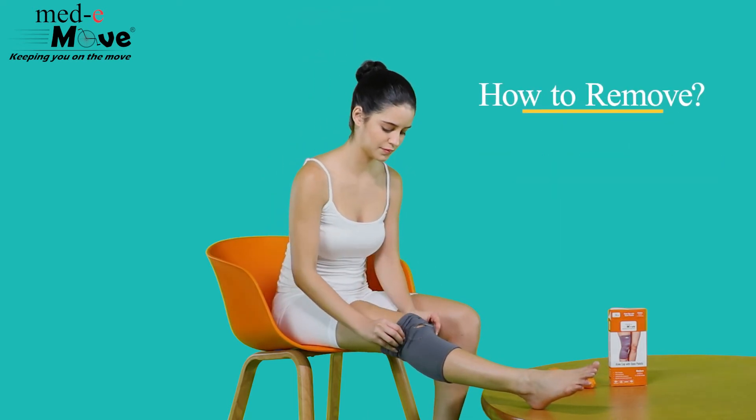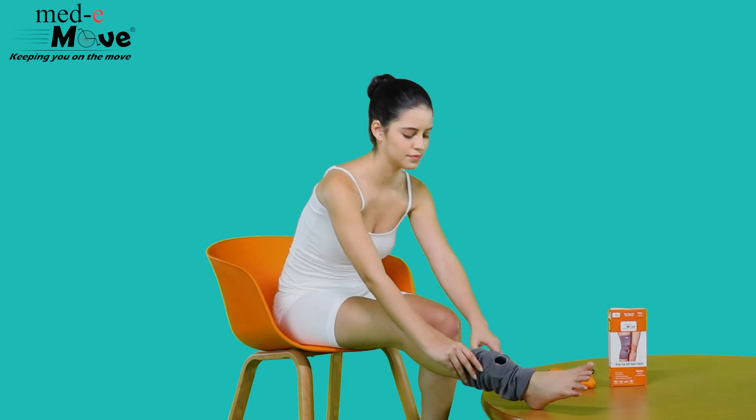Now let us see how to remove the kneecap. Simply pull the kneecap down for easy removal.